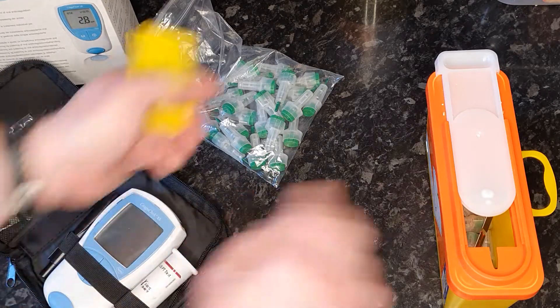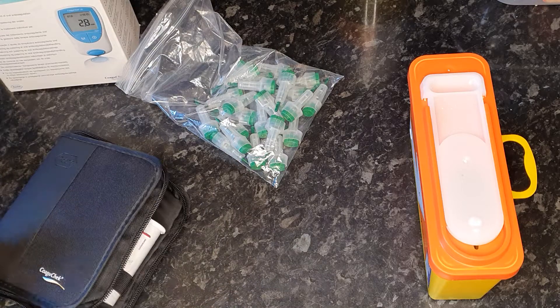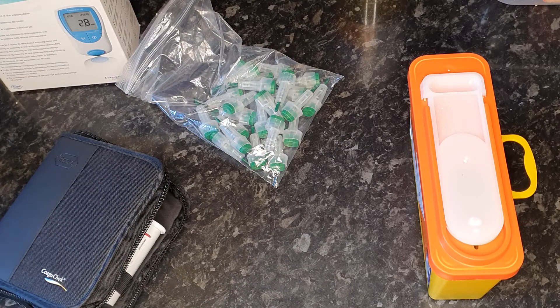Last thing to do of course is to close the sharps container, but not all the way because it locks. And that's it — that's how you do a home coag check. Thank you.